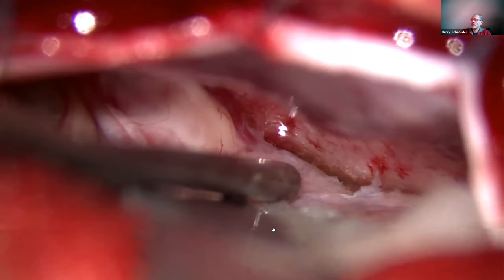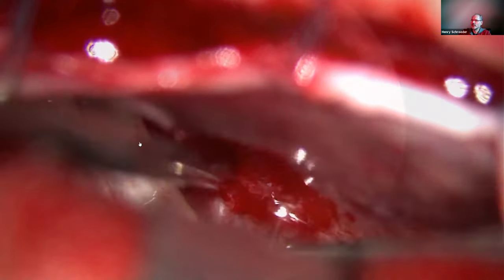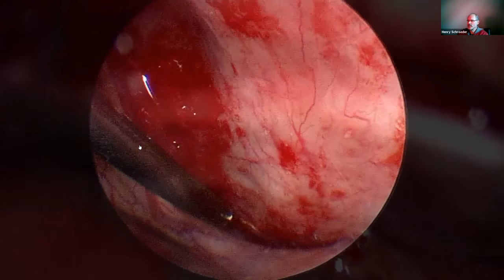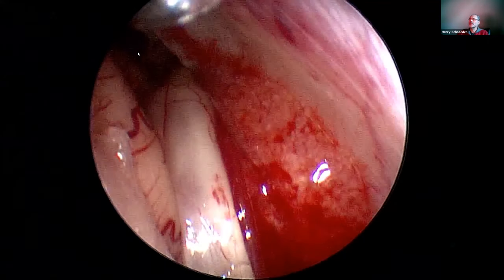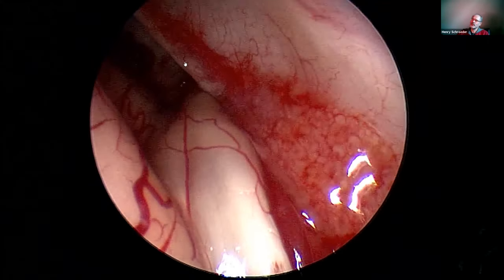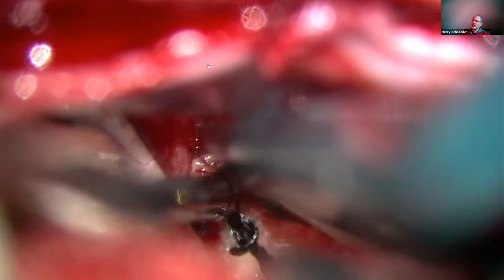So we make an eyebrow approach. You see, this is a right olfactory tract. It's involved in the tumor, and you see the difficulty in olfactory groove meningiomas is to look to the base of the olfactory groove. Especially if the olfactory groove is very deep, you cannot see. You cannot see it with a microscope. You need an endoscope to have really an overlook of this area. So olfactory groove meningiomas are a very good example when you use an eyebrow approach that you need an endoscope.